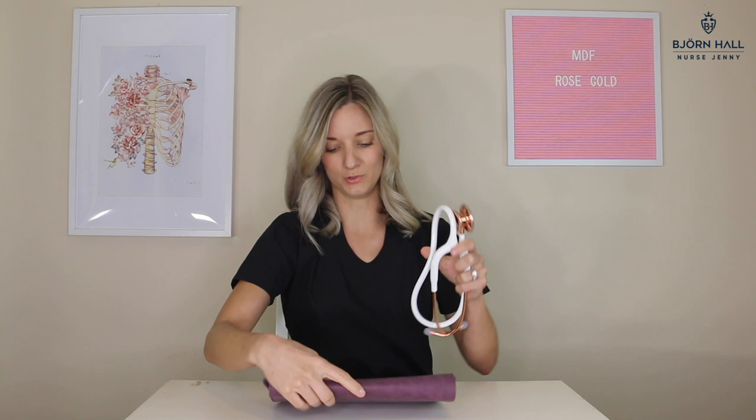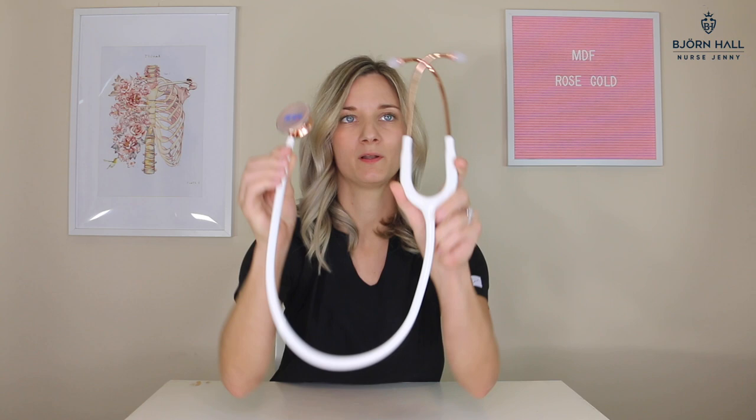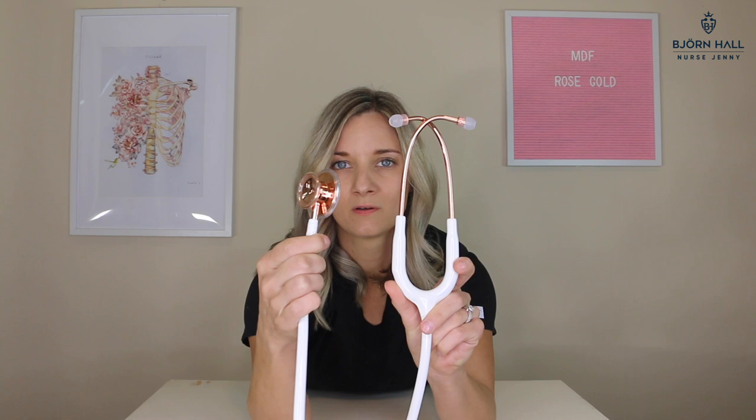I'll show you a little bit closer up what it looks like — I'll do a little slow turn. Don't get mesmerized; you may have to wear sunnies. As you can see, it's very nice, shiny, pretty, rose gold, white, perfect. I may shovel shit at work, but that doesn't mean I can't have something nice.